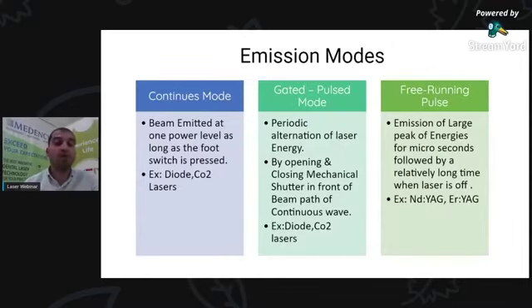This mode makes our laser come in shots or small patches. How can we do that? The main mechanical system that makes our laser come in pulsed mode is a gate placed beyond the mirror we talked about. It is a small gate which closes and opens and makes our laser come in a chopped or pulsed way. This gives the tissue something we call tissue relaxation time.